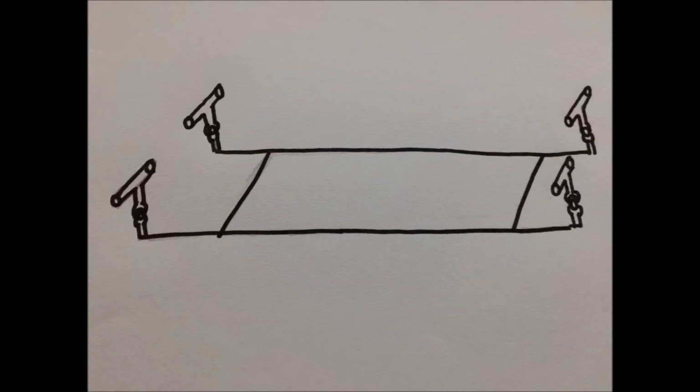Design. This is the concept design of the actual product, with 4 handles each attached with ball joints to ensure a steady stretcher while being used.